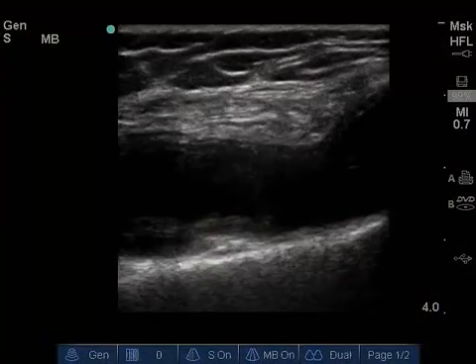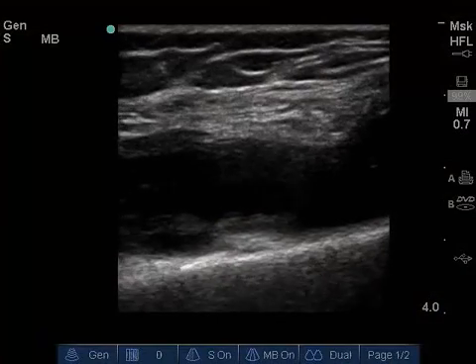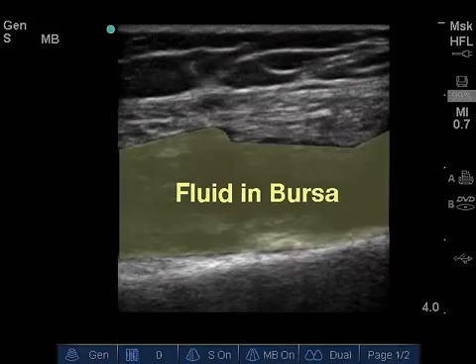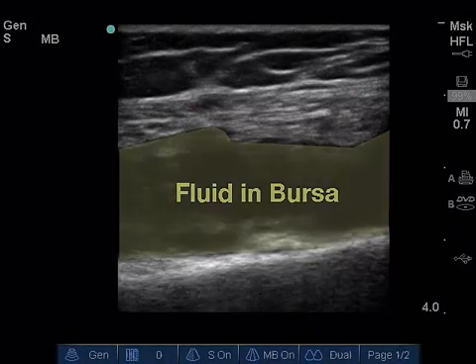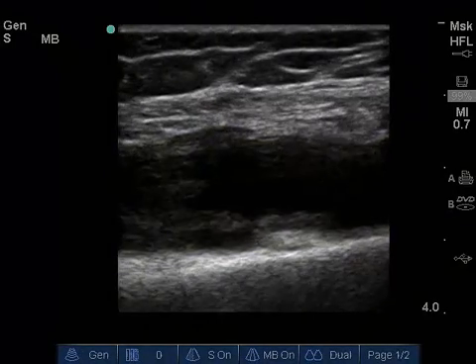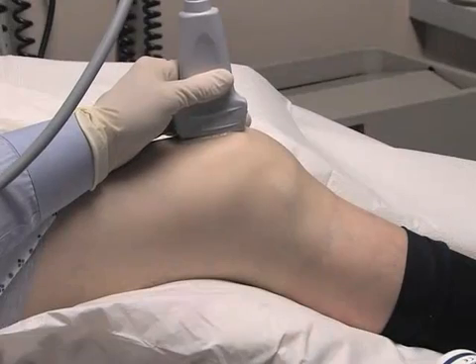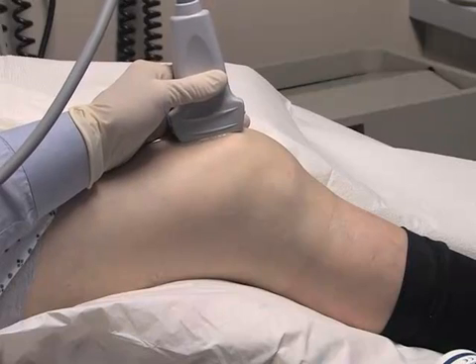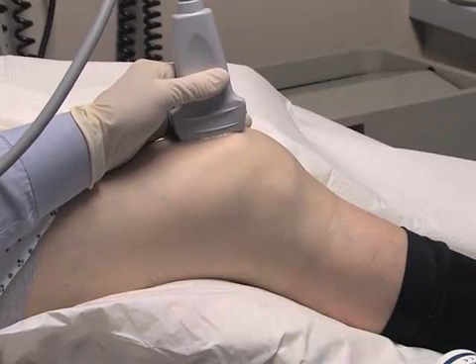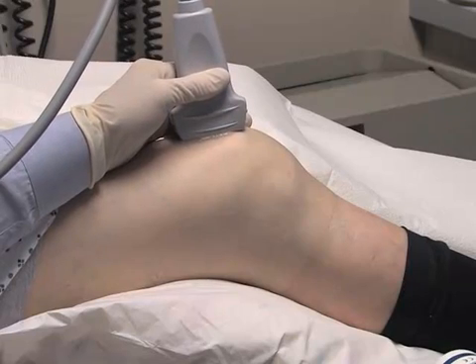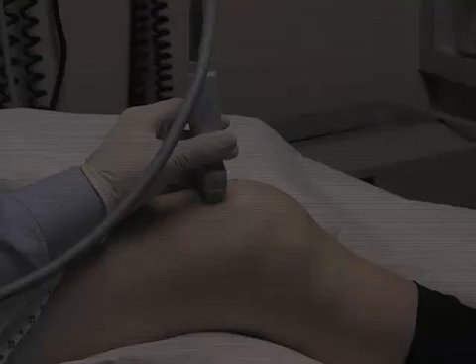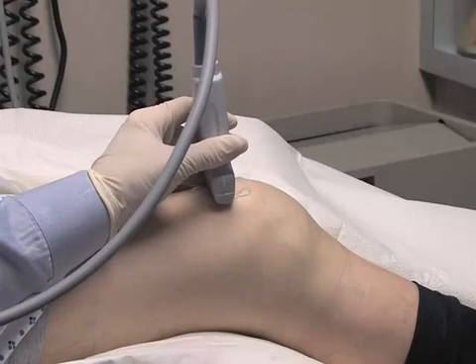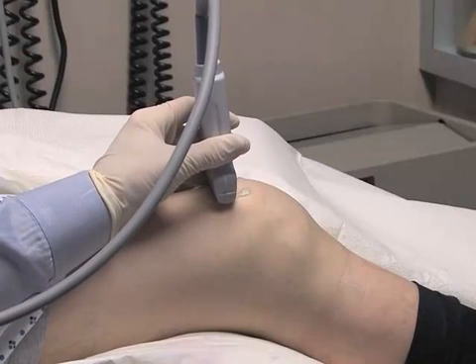Therefore, fluid identified in the suprapatellar bursa indicates the presence of fluid in the joint itself. Ultrasound enables direct visualization of fluid collections in the suprapatellar bursa and knee joint, and determination of the appropriate location and depth of needle insertion.